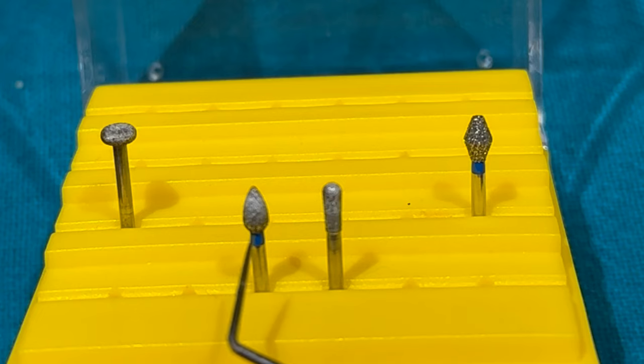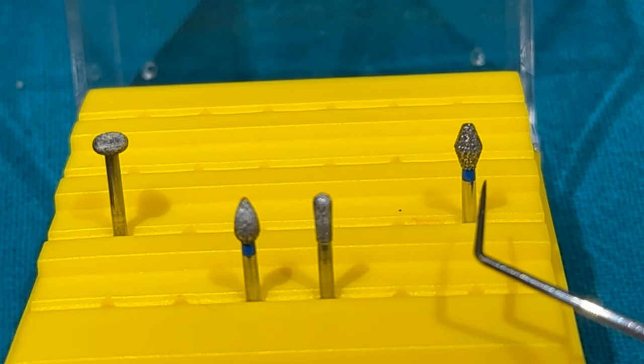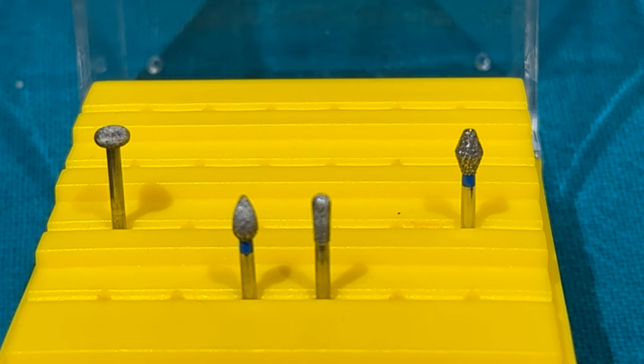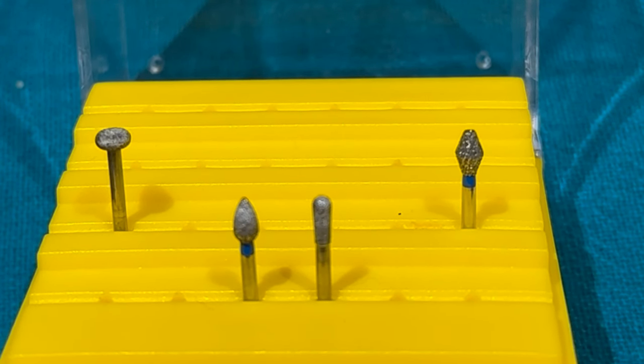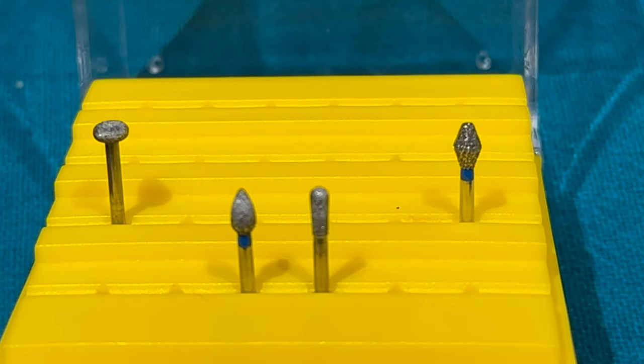Pear-shaped, football-shaped, donut-shaped, and barrel-shaped burs — all these burs can be used for anterior lingual reduction. They can also be used for occlusal reduction of the posteriors if required.